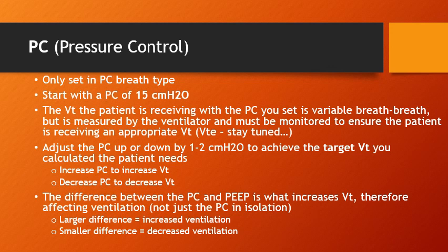And that makes sense because if we increase that pressure control number, we're telling the ventilator that it needs to meet a higher pressure. So to do that, it's going to blow more air in. And blowing more air in just means that the patient's getting a larger tidal volume. It's going to keep blowing air in until it meets that higher pressure, and that's going to result in a higher tidal volume.